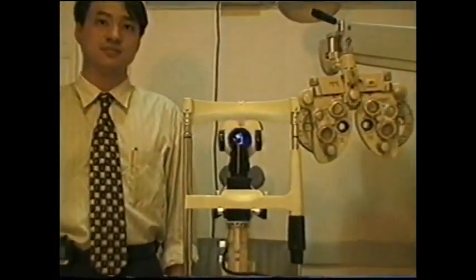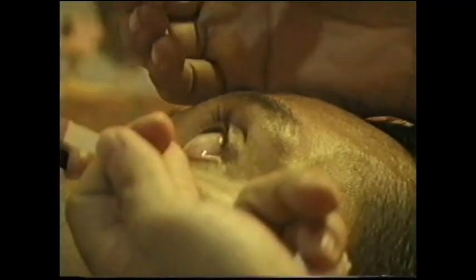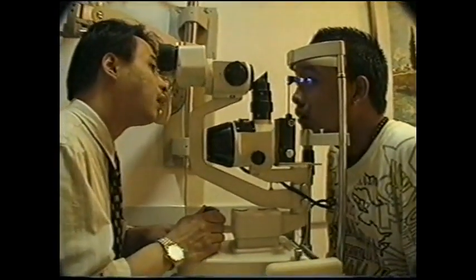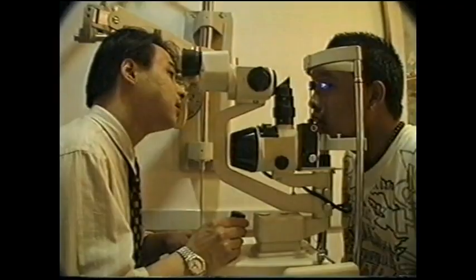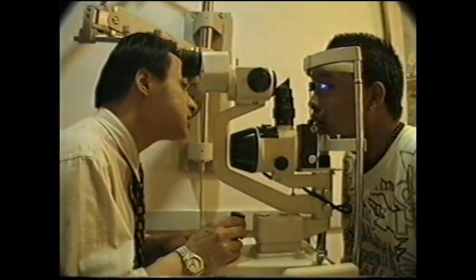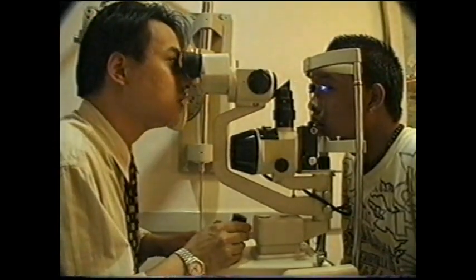Performing Goldmann applanation tonometry. Insert a clean tonometer tip in the biprism holder. Instill a topical anesthetic drop and fluorescein dye into each of the patient's eyes. Seat the patient at the slit lamp with the patient's forehead firmly against the headrest and chin comfortably on the chin rest. The patient's eye should be aligned with the black band on the headrest column. Instruct the patient to look straight ahead and to open the eyelids wide.